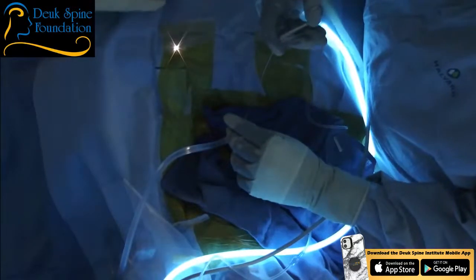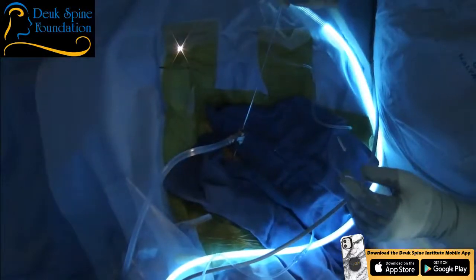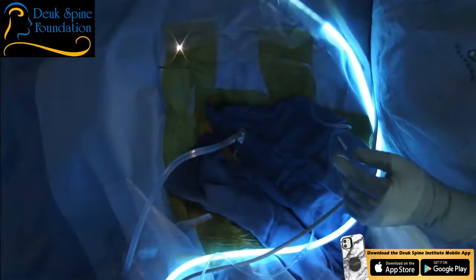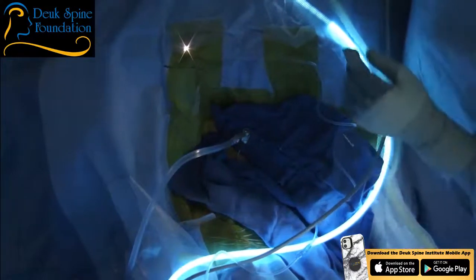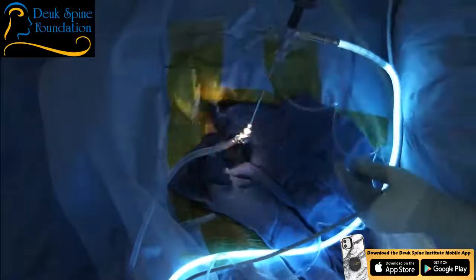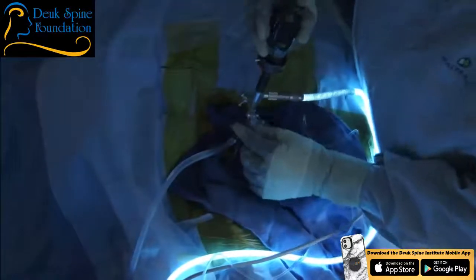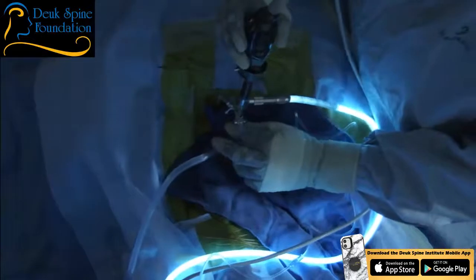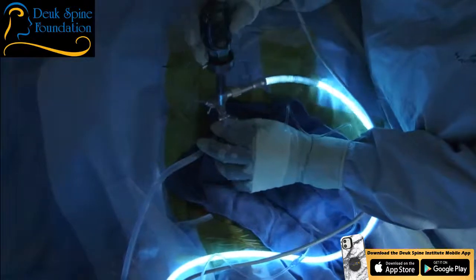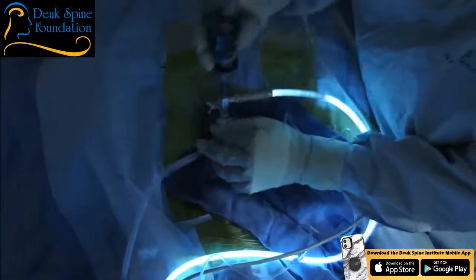So when we talk about a disc herniation, we always talk about it in the singular, but the herniation is really made up of multiple fragments of disc. Just on the MRI, it looks like one, but it's really 10, 15, 20 pieces. Rarely do you get one giant piece. Rarely, like probably 1 in 50, maybe 2 in 100. But mostly it's little chunks like this guy right here. And you just got to patiently remove all the little chunks.